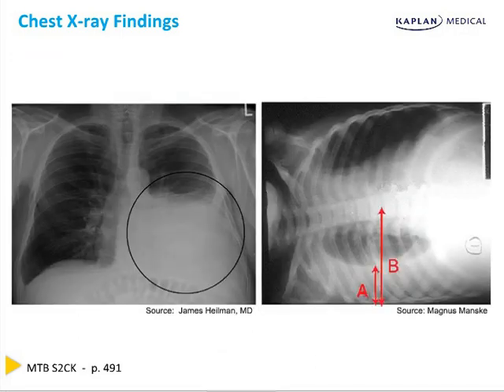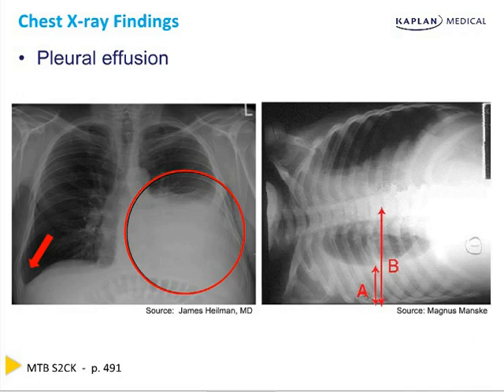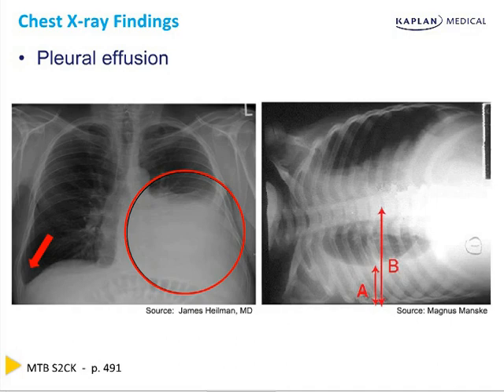The image on the left shows a drastic example of a pleural effusion, which results from fluid accumulation in the space between the visceral and parietal pleura of the lung. This condition is most often associated with left heart failure, but can result from many other etiologies as well. The classic finding of a pleural effusion on X-ray is a radio-opaque area in the dependent region of the lung. White out of the costophrenic angle is the initial finding of pleural effusion on an AP film, and as the fluid volume in the pleural space increases, the amount of lung that is whited out will also increase. The image on the right is a lateral decubitus film confirming the pleural effusion by showing that the fluid changes position when the patient lies on their side, as noted by line A.